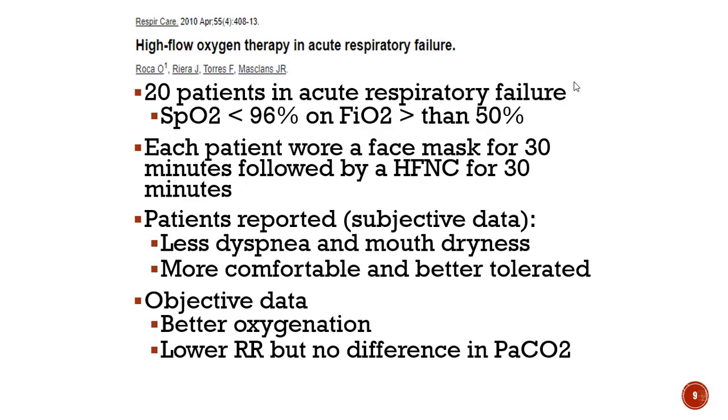Objective data, however, was that the people wearing the high flow nasal cannula actually had better oxygenation and a lower respiratory rate. So that's kind of where they started realizing that this could give a small amount of CPAP and help to overcome some of those other work of breathing issues that are commonly associated with people needing a higher FiO2.